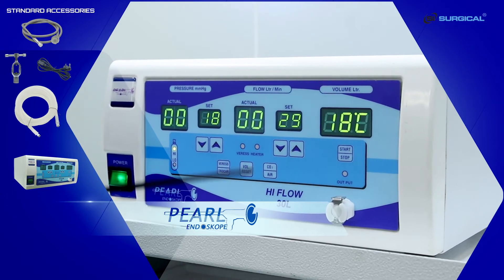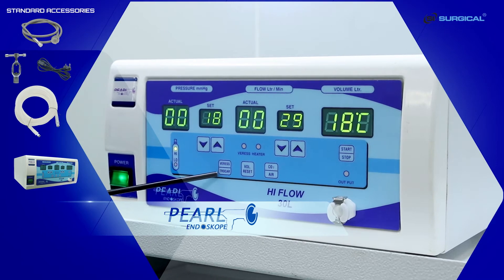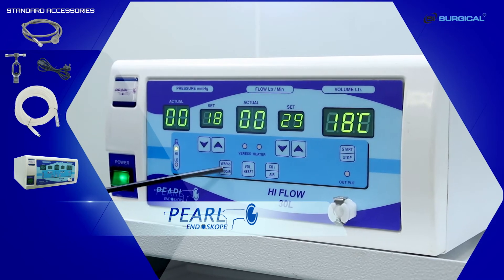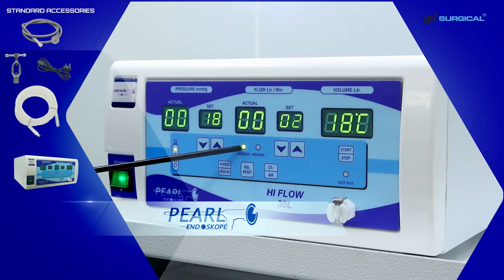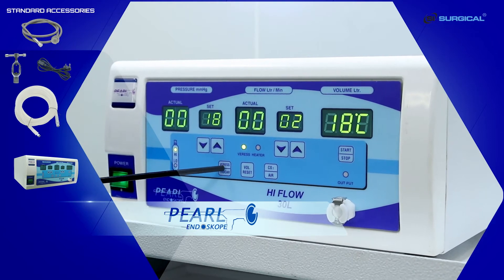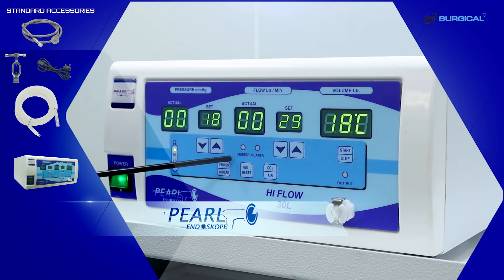This is the Veress and the trocar mode. This LED indicates that the Veress mode is activated. If the LED is not lit, it means the trocar mode is activated.